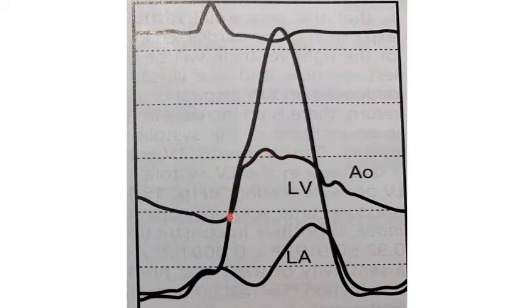Yes, sir. So, in dynamic obstruction, the initial part of the aortic pressure curve will move along with the left ventricular pressure curve. And then as the obstruction sets in, there will be a gradient. If it is a fixed obstruction, the gradient will be from the early part of the LV. As soon as the LV pressure crosses over the aortic pressure, there will be a gradient. The peak is delayed, and the closure also is delayed. So this is a dynamic obstruction, and then the LA pressure.